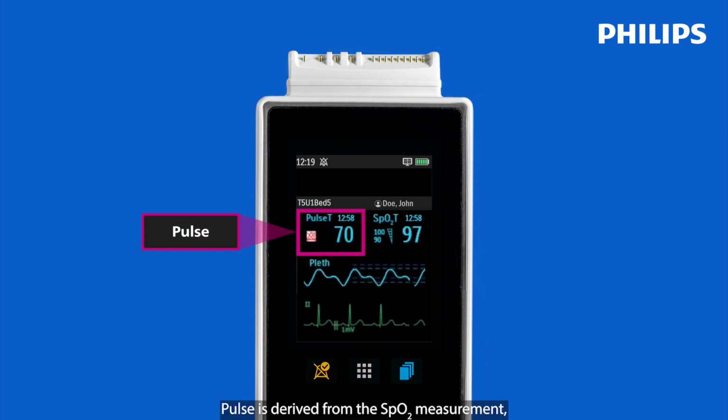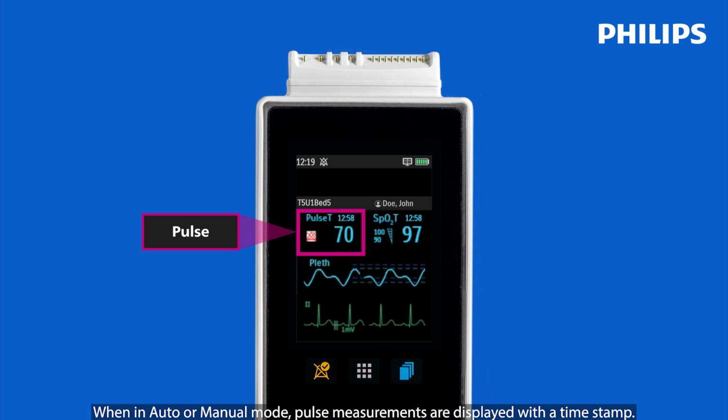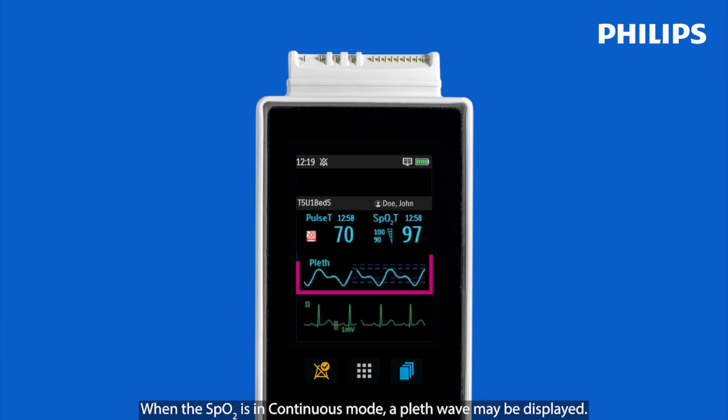Pulse is derived from the SpO2 measurement, and the pulse numeric is displayed when SpO2 is being measured in any mode. When in auto or manual mode, pulse measurements are displayed with a timestamp. When the SpO2 is in continuous mode, a pleth wave may be displayed.